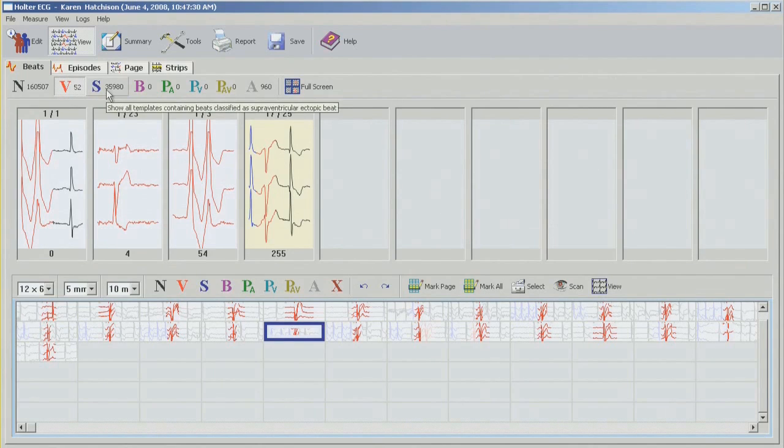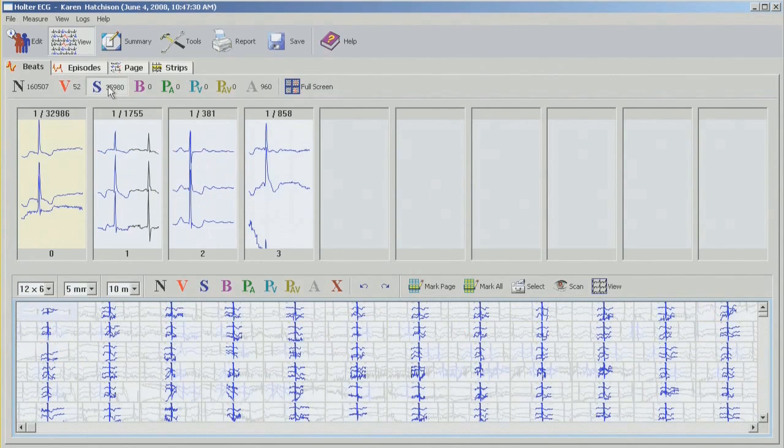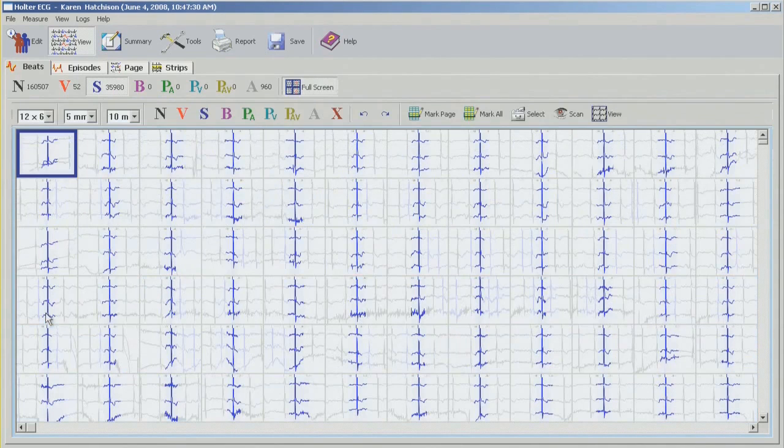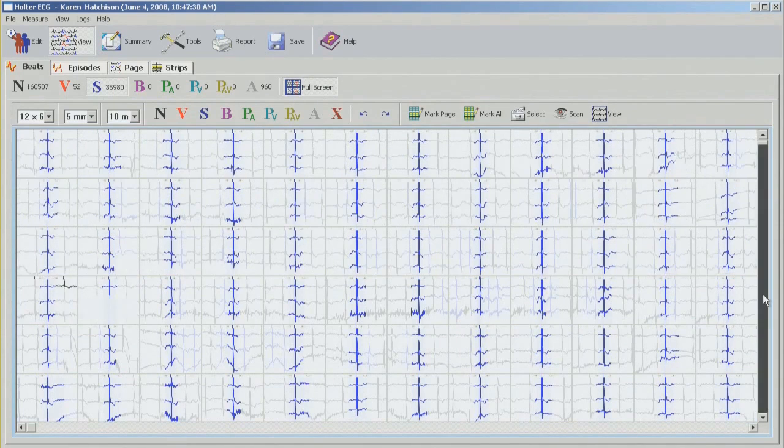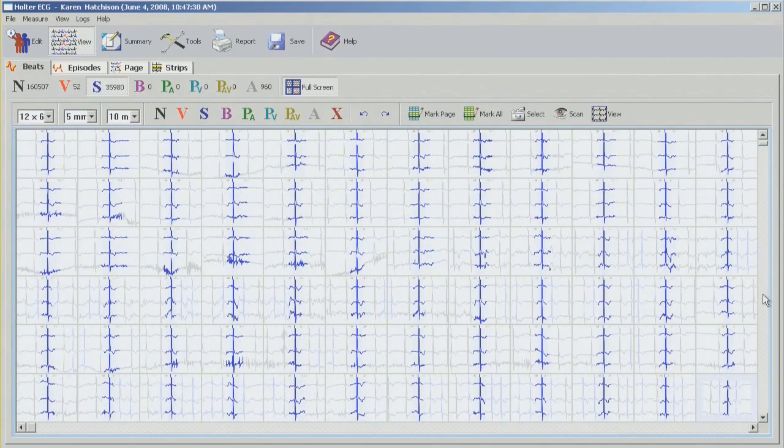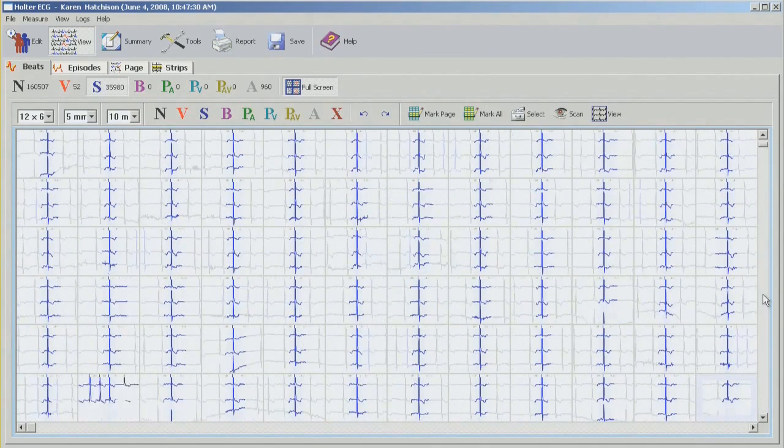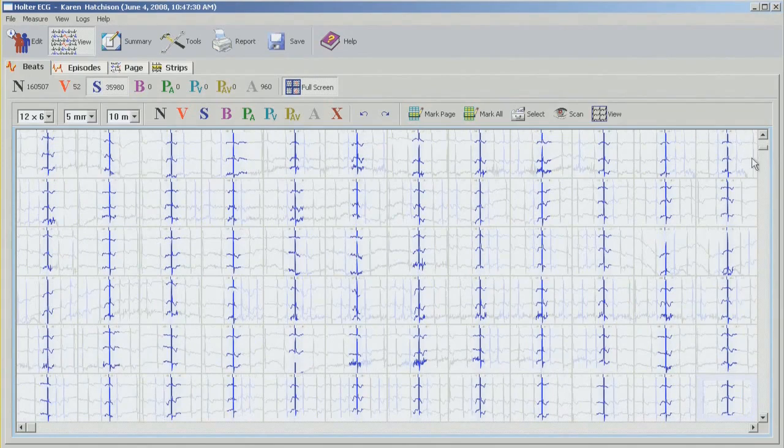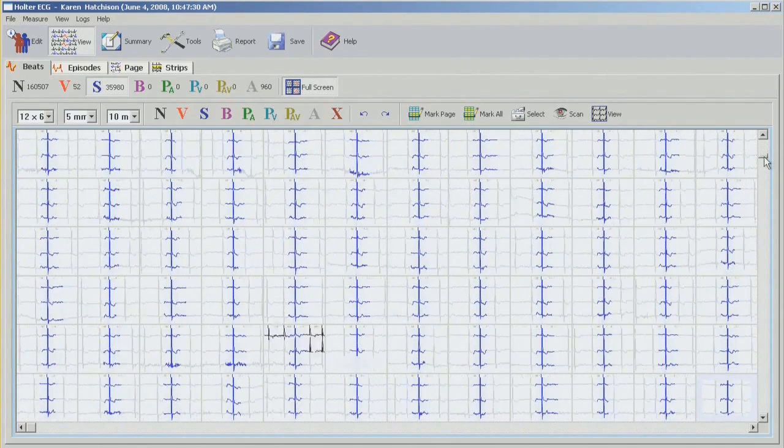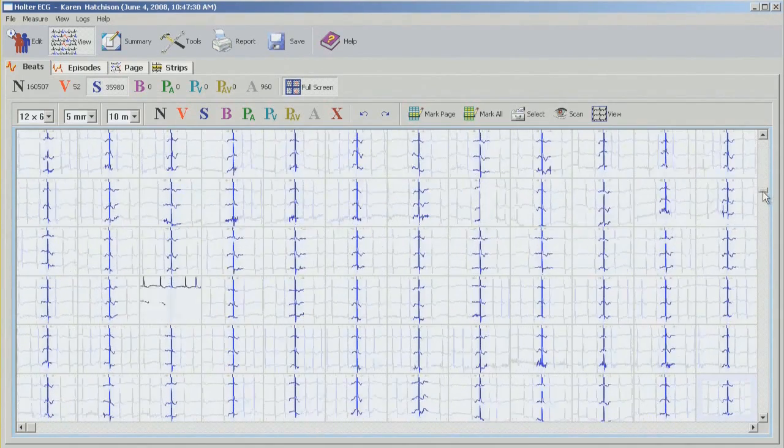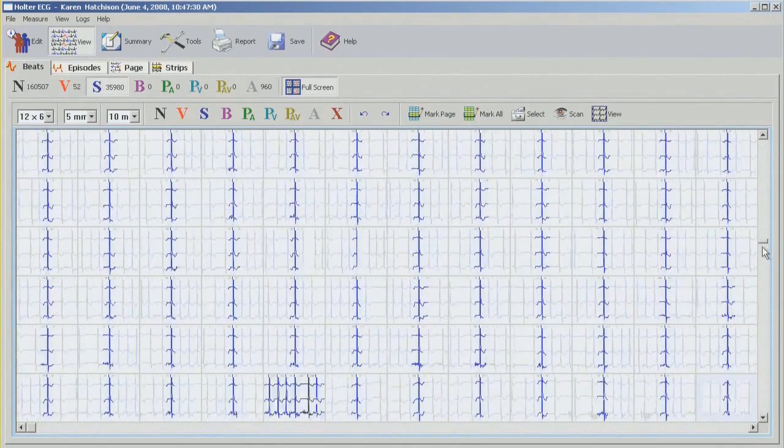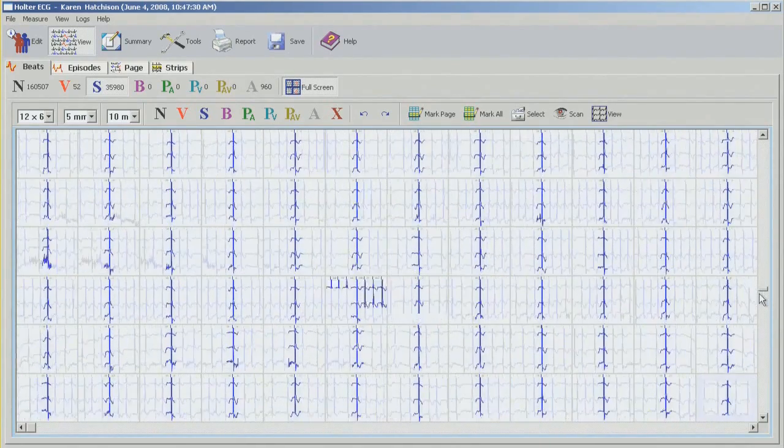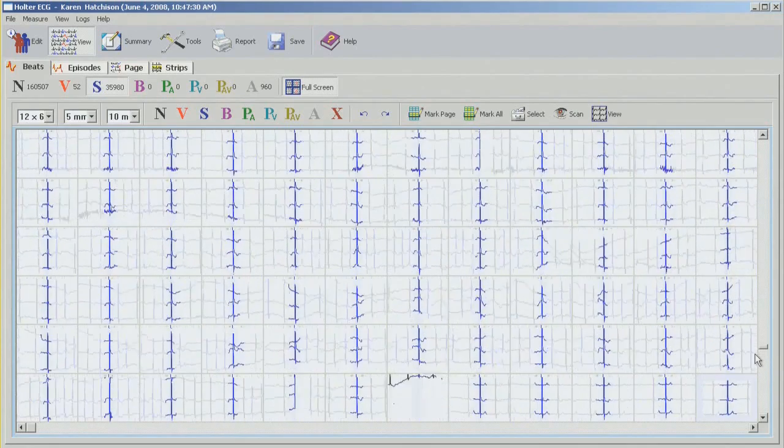We're going to move into the supraventricular bins. Now, since this is AFib, obviously none of these are correct, or all of them are correct. But I'm just going to quickly scroll through those, just to make sure there's no VPBs hiding in here. So it's going to be a long process with 35,000 beats. So I'm just going to quickly drag this down. All of these should be labeled correctly, but just want to make sure there's nothing missing in here.